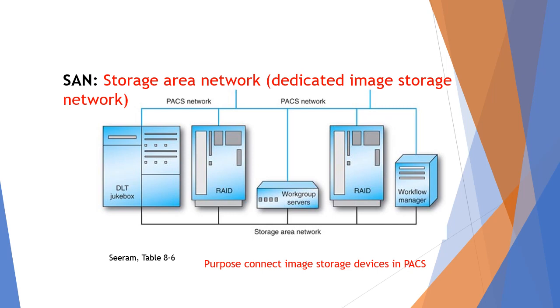SAN is Storage Area Network, and it's a dedicated image storage network. So we can see we've got the DLT, the jukebox, the RAID, and then another RAID, Workflow Manager and Workgroup servers. And the purpose is to connect image storage devices in PACS.